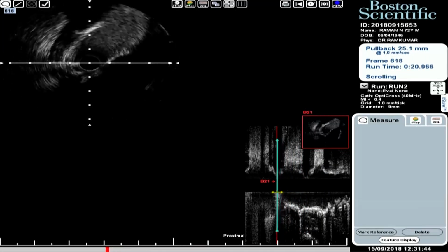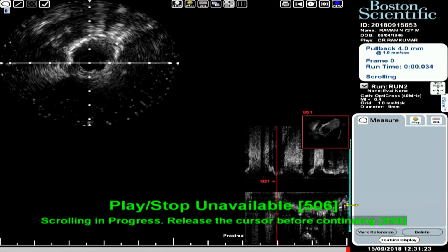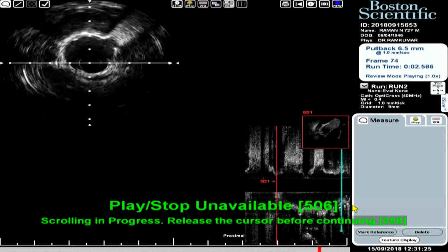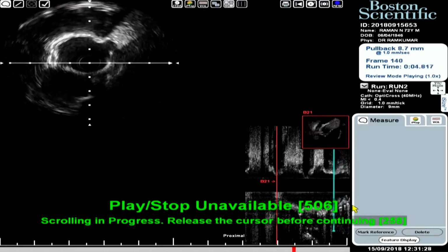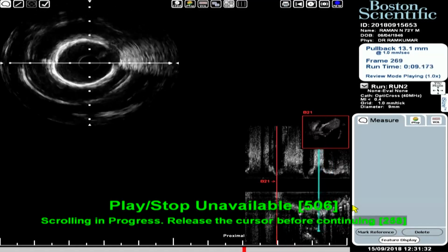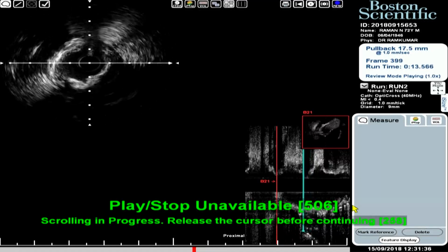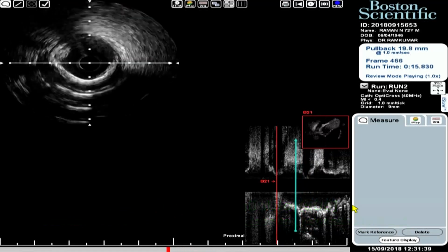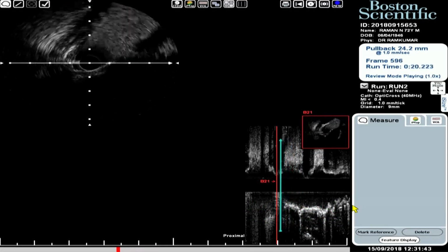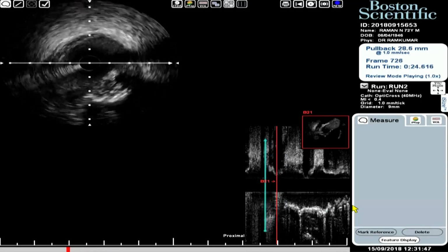We used so many things. Anyway, let's now keep our fingers crossed and hope it expands now. So any other suggestions here? We've gone with the OPN at 3 to 35. And then we've gone with the 3 non-compliant to 30. Now, do you think a cutting balloon will have a role here? Maybe a 3 OPN balloon, a cutting balloon. We put a calcium cutter, 5 cuts at two places. It might not expand fully after stent implantation.